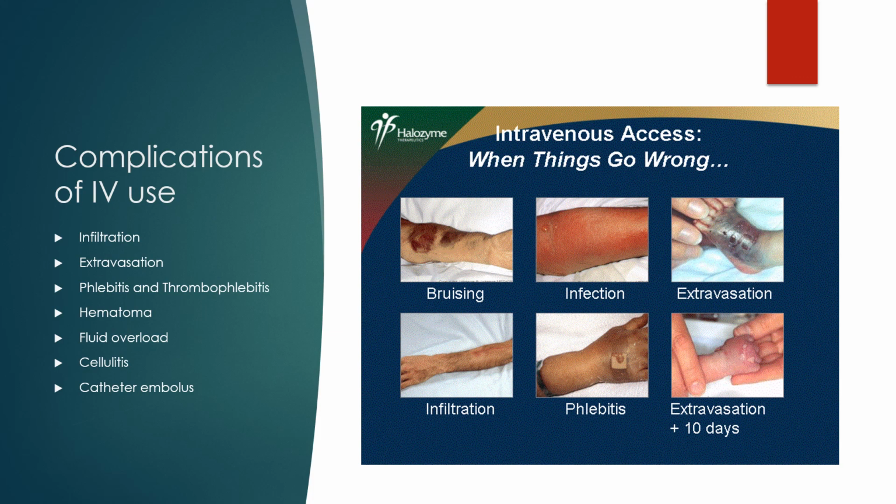And then that last one is a catheter embolus. This is when the tip of the catheter literally just pops off and is floating around in your blood vessel. So when we think about prevention of this, if it's a peripheral IV, I don't ever remove the plastic sheath from the tip of the IV and push it back. So if you feel resistance, if you don't have your needle in that sheath, you should not be manipulating that sheath. It's going to cause something to maybe pop off.